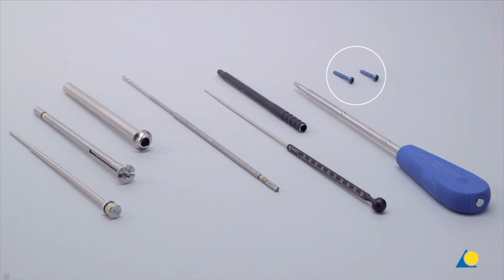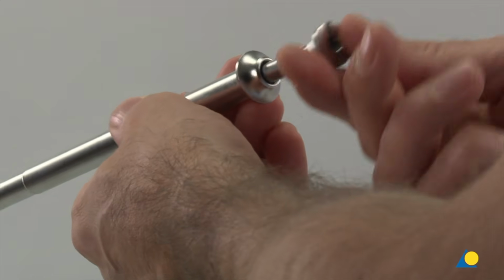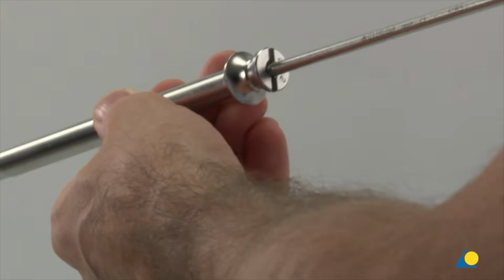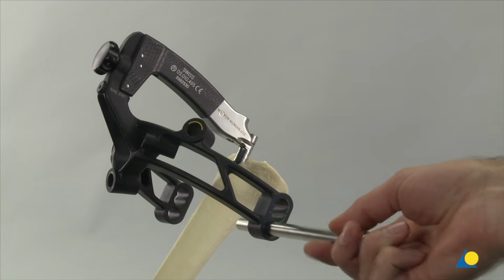It should be noted that the blue color of the screws corresponds to the color of the nail, as well as the blue markings on the 3-part trocar combination and drill bit, as well as the aiming arm. The 3-part trocar combination, which consists of the protection sleeve, drill sleeve, and trocar, is assembled. It is then inserted through the hole in the aiming arm marked Stat 1, through a stab incision, down to the surface of the bone.